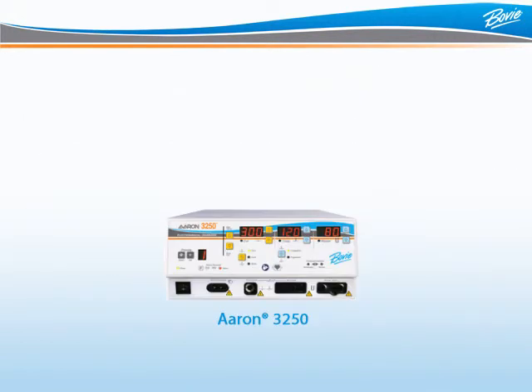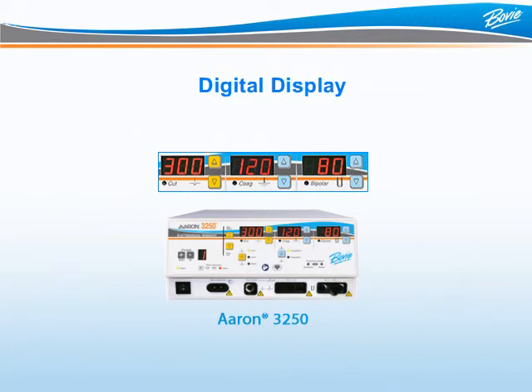When powered on, the Aaron 3250 automatically powers up to the last activated settings and performs a safety system check. Like all Aaron generators, the Aaron 3250's illuminated digital display is expressed in watts. To adjust the power output, simply press the up-down buttons to the right of the number.